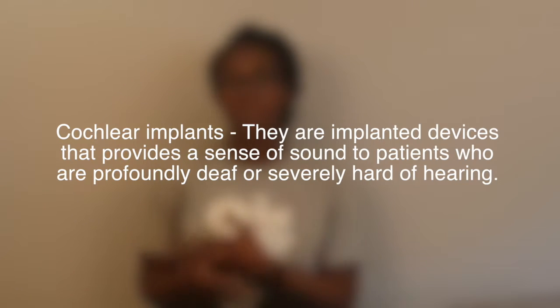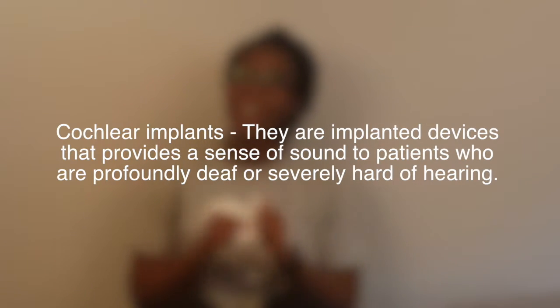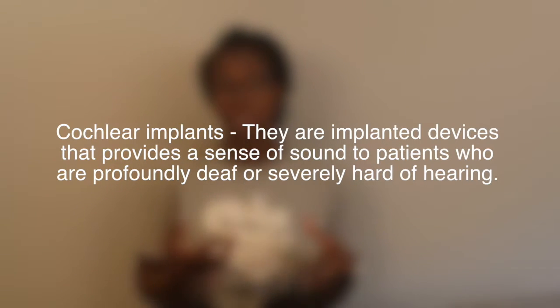Another type of implant is cochlear implants. And as you know, a cochlear implant is basically a device that provides a sense of sound to patients who are profoundly deaf or suffering from hearing loss.